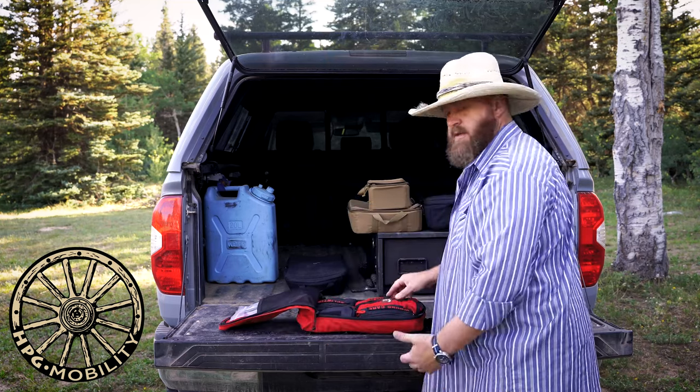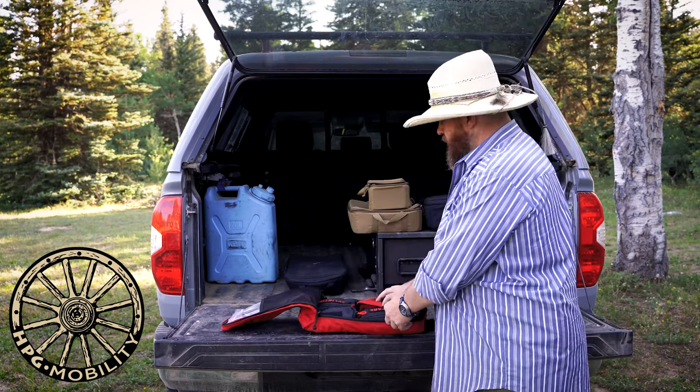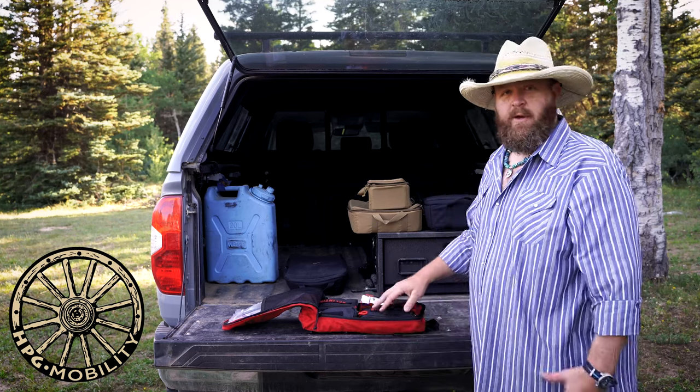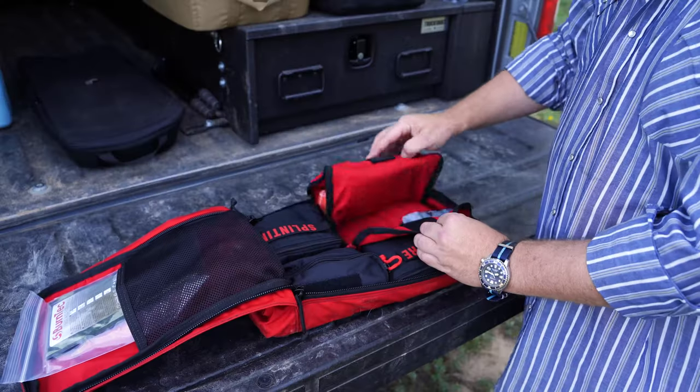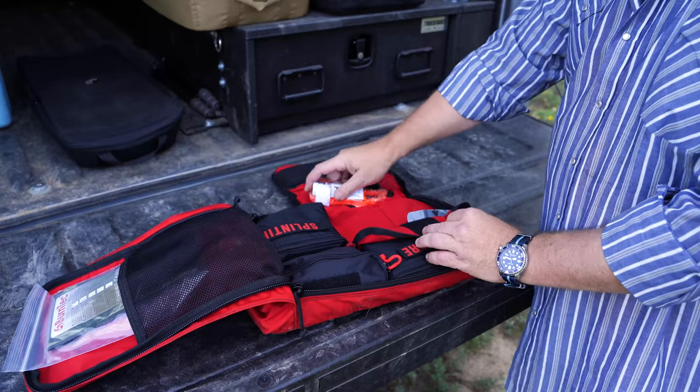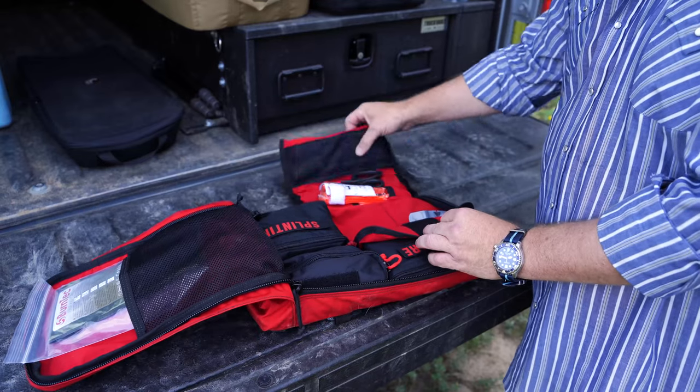Personally I've laid it out so that the trauma is something I can get to really easily here just by pulling that tool roll out. So I don't have to pull anything out of the bag, I don't have to undo any zippers — it's simply a matter of ripping velcro and flopping, and then I have access to all that stuff.